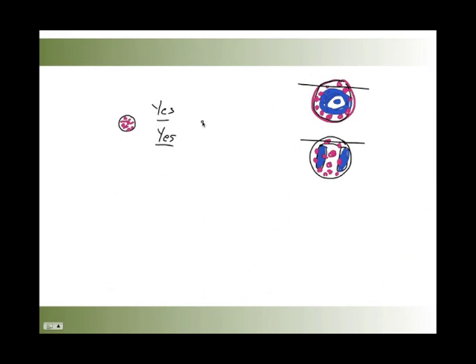And there are going to be instances where you can't identify things, whether that's from a practical nature, that is the plane of section is a problem, or whether it's a staining issue and you just can't really figure it out. I can assure you that any examples we may give you in a test environment are going to be very, very clear. But if you're just interested in figuring this stuff out for yourself, understand that sometimes it's not worth making the distinction, because sometimes you can't have a good answer. With that in mind, let's take a look at the second profile that we're interested in.